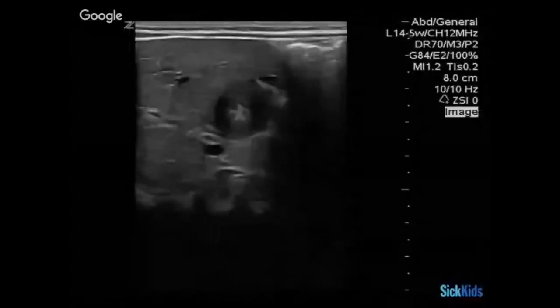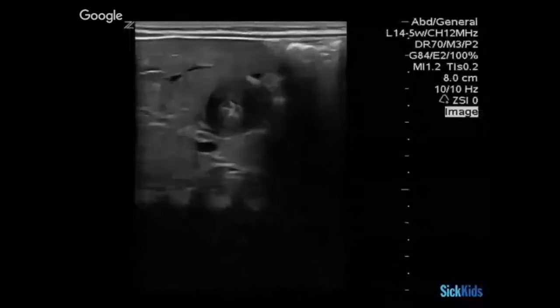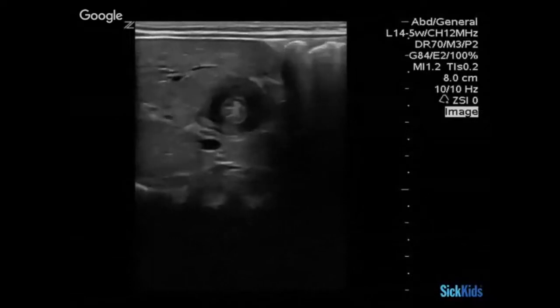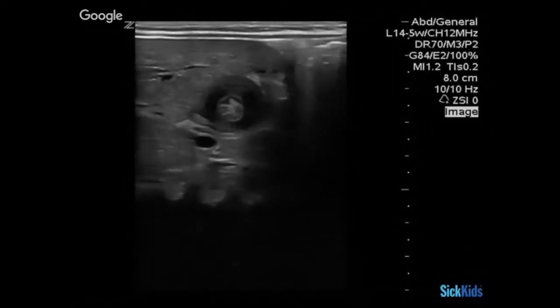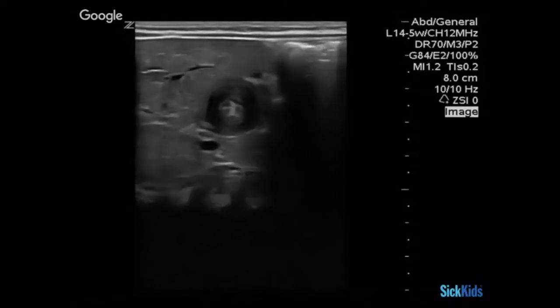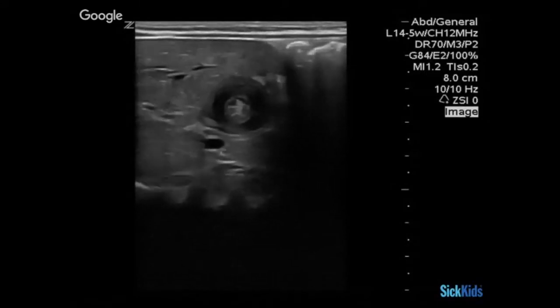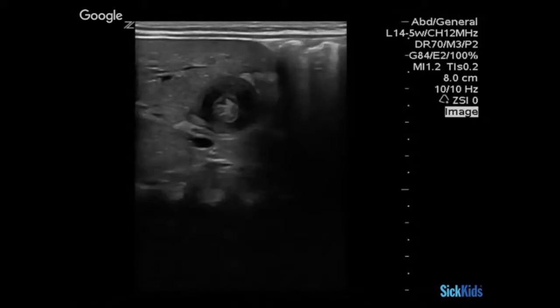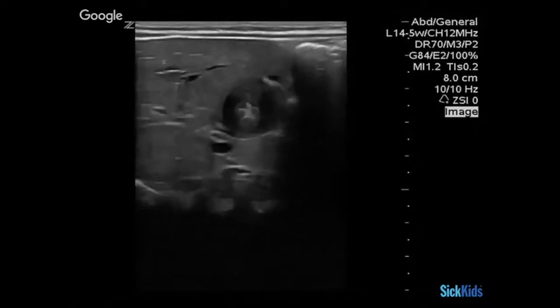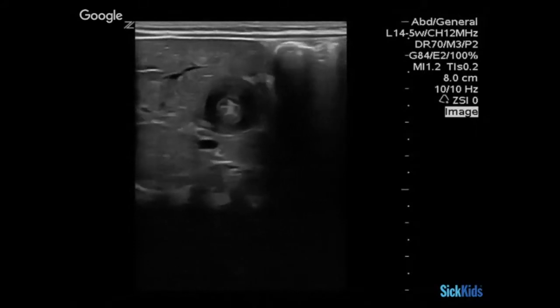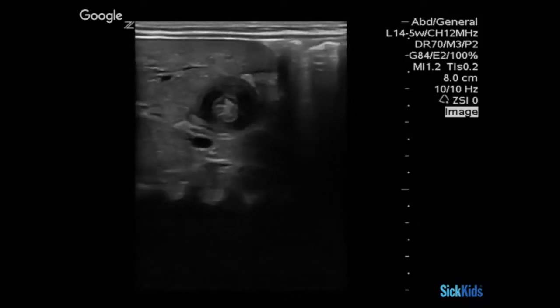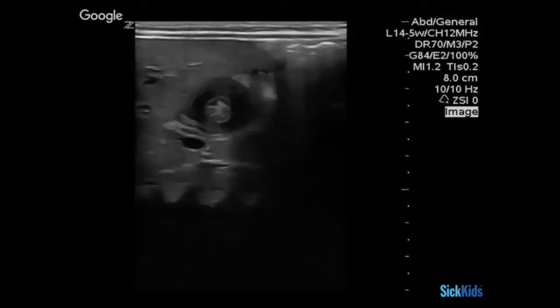Finally, a couple of other images looking at the pylorus in its transverse plane. This is something to be aware of and not forget about as you're looking around for the structure. If you see this, you may have identified the pylorus without realizing it, because we're used to thinking about it in the longitudinal plane — but remember, this is what it looks like in the transverse plane.